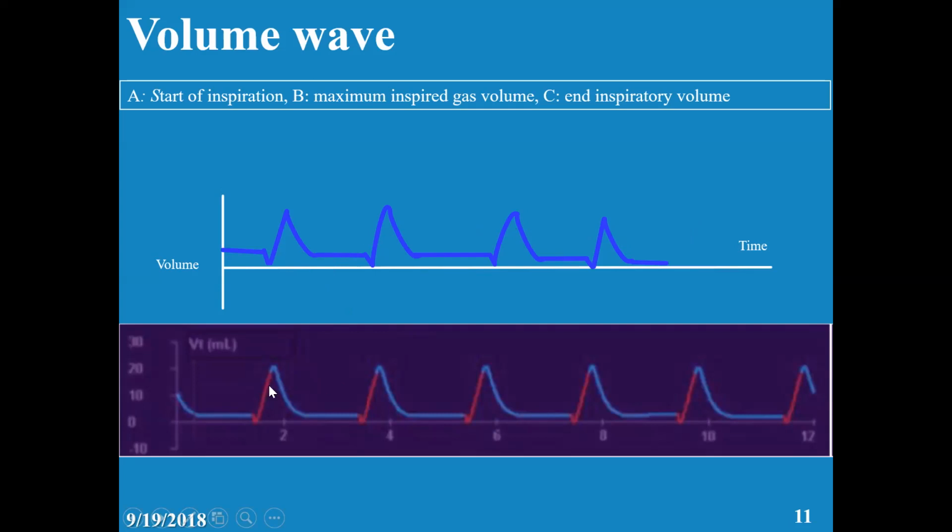And in this advance, you can see two colors. You can see the patient contribution and then the machine. So patient, machine, patient, machine, patient, machine. And the patient achieves almost like 90% of the volume. So these are assisted. So if it's assisted, what type of mode do you think mostly? What type of the modes that have assisted breaths according to yesterday's session?